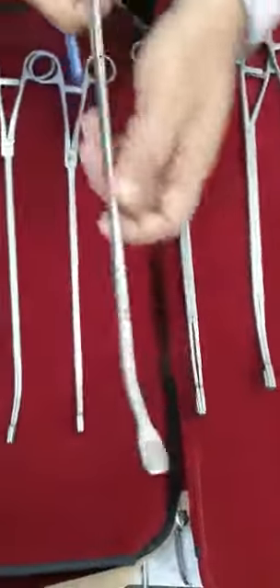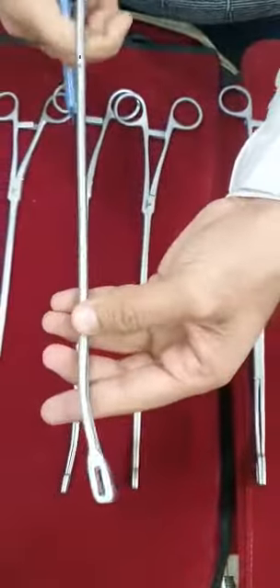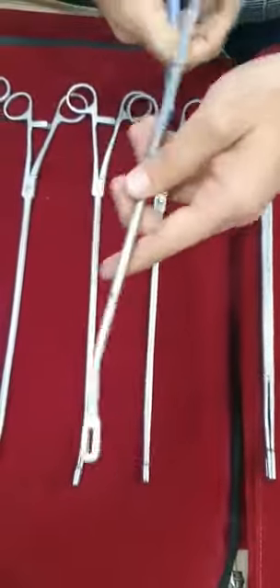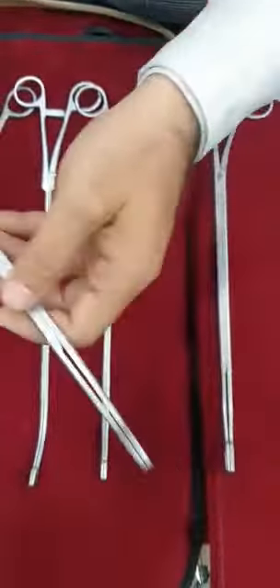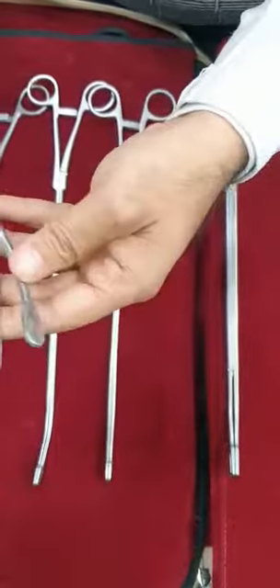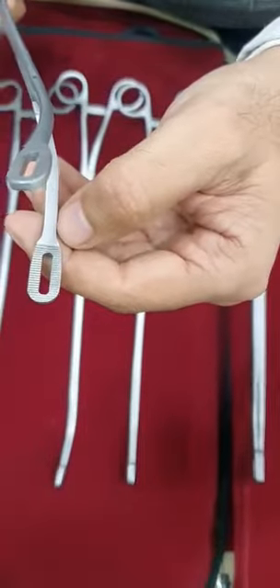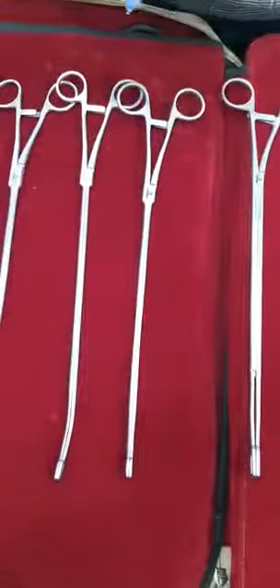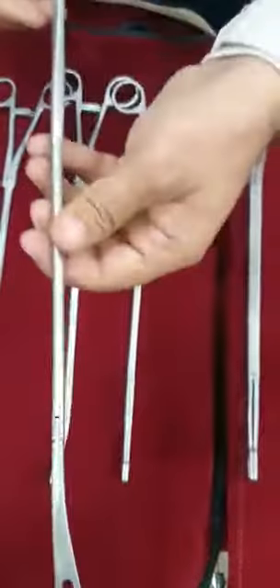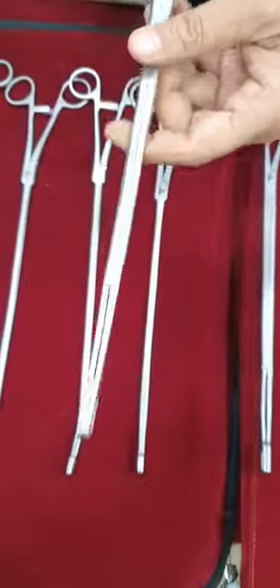Then we are having this sponge holders, just to hold the tissues and sponges during the surgeries. I hope you appreciate the teeth. It is traumatic. There is the oblong type sponge holder.